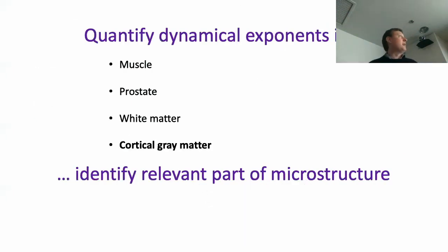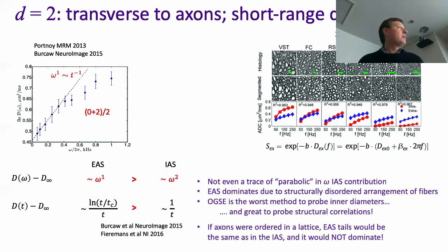Okay, and so now let me go to course. So that 20 micrometers is probably just how tightly the fibers are packed, right? The distance between neighboring fibers. Here it's about a micron. Yeah, but you said that the 20 microns is actually a wrong measure of the intra-axonal diameter. Yeah, people were getting 10, 20 microns as axonal diameters. But if you say it's dominated by the extra-axonal water, yes, it's actually a reflection of the distance between two neighboring fibers. Well, then you have to model that, so there are coefficients in front of this.